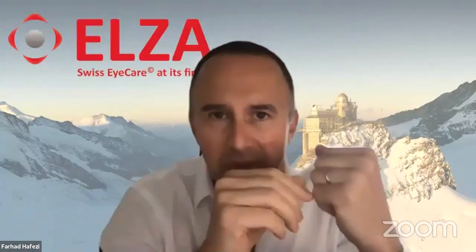Our approach was different. We started from scratch and said, this is the thickness of the cornea. We developed a formula that respects oxygen diffusion and riboflavin diffusion, and we individualize the fluence. So I think these are two ways to roam. The advantage our method has, I think, is it keeps it simple. If you have a very old device that can only do 3 milliwatts, you can do everything with our protocol.